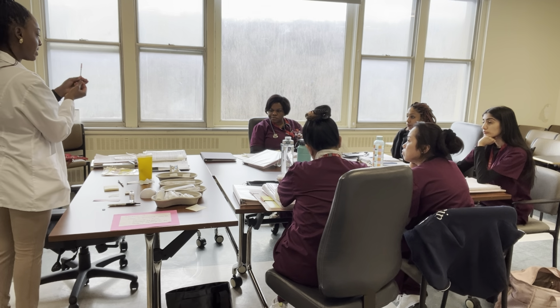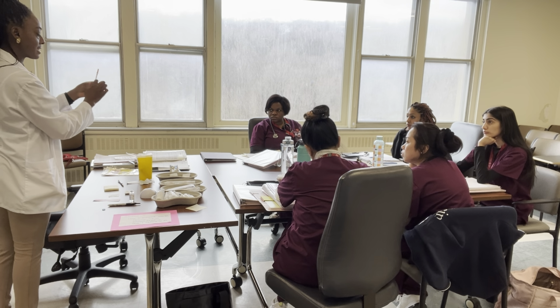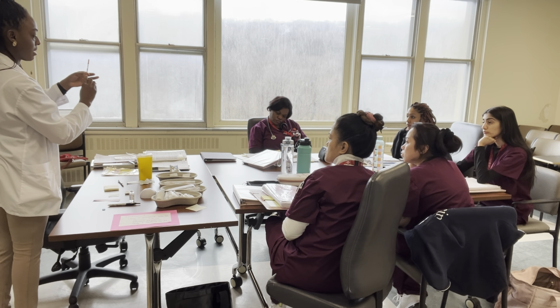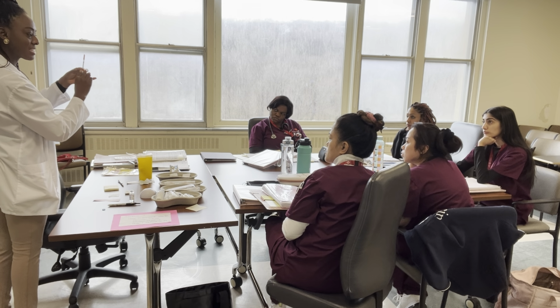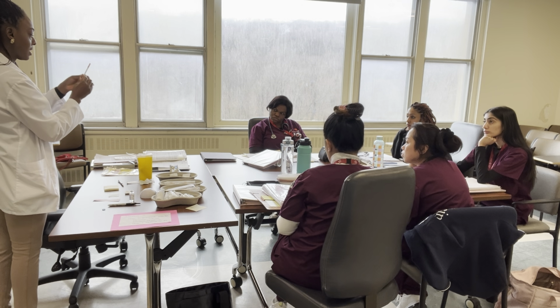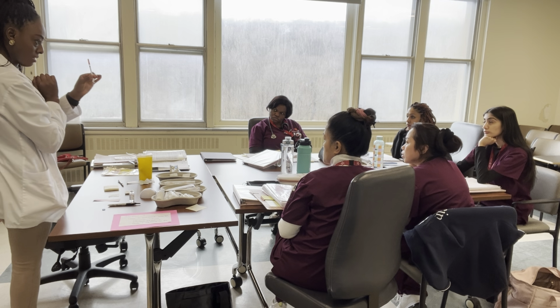Then I'm going to pull up the amount of insulin that I need, but before you do, you need to release the suction inside the plunger. There's a negative pressure, so you have to pull down and then up, and it releases the pressure inside of it, okay? Then you go directly to the number you're going to be administering, so units.